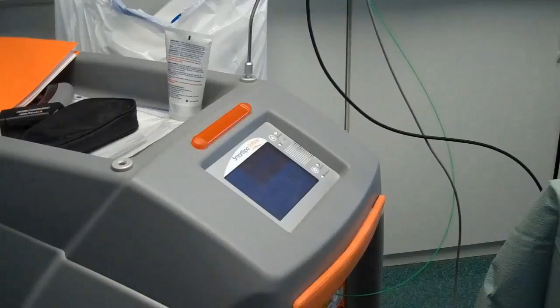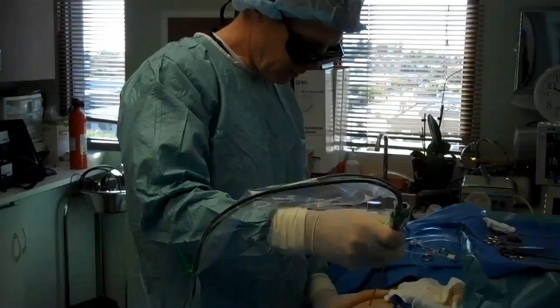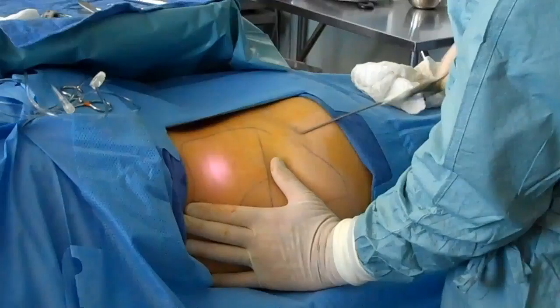I've already numbed her up; she's had a little sedation so she's comfortable. I'm putting in a little lubrication. There's a little popping noise — it's the laser being delivered into the fat layer to melt it.